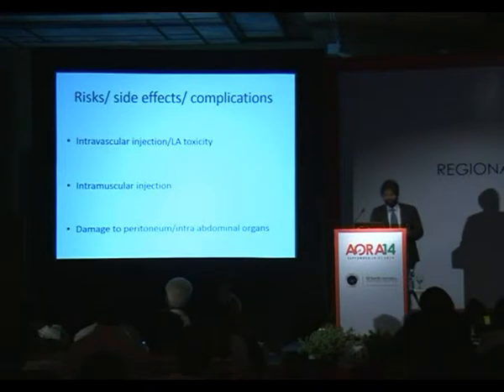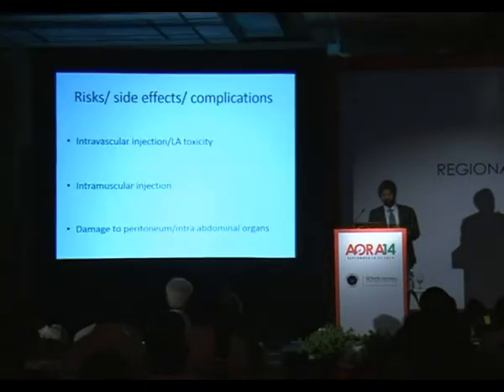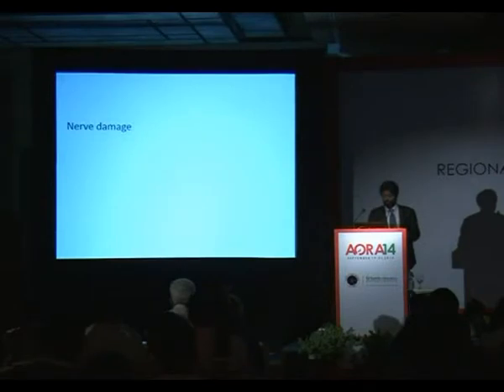It's a supra-inguinal technique, so there is always a risk of damage to the peritoneum and the intra-abdominal organs. But there are a lot of things which would help us with that. You have put a probe there which is pressing upon the inguinal ligament. Then you are getting your needle through the sartorius, so the needle entry point is infra-inguinal. And we're not moving the needle anywhere but in its own space that has been hydrodissected by putting in local anesthetic. So that should make it a very, very safe technique.